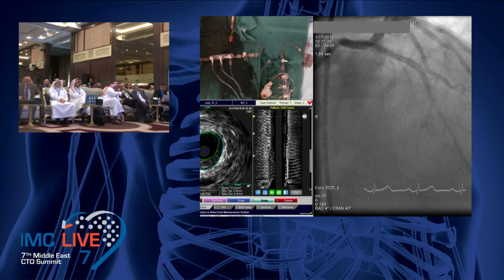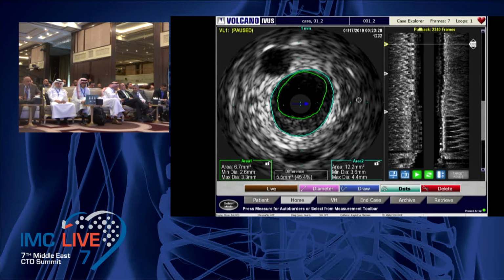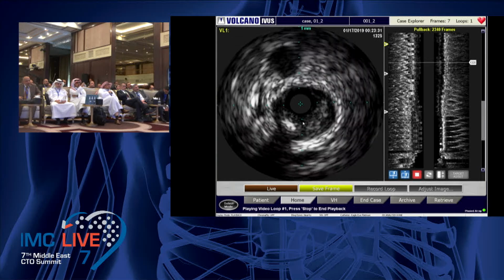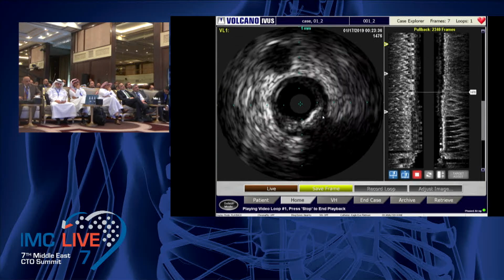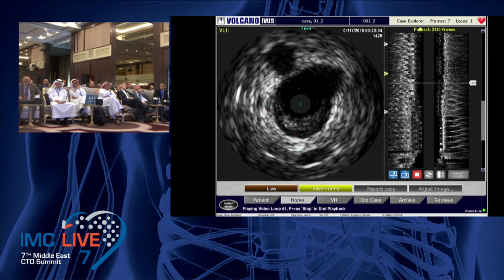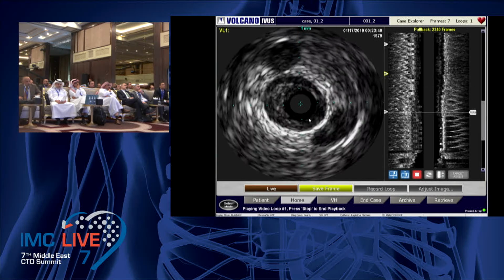Yeah. Okay. We are here in the distal LAD, where there is a healthy segment with minimal plaque. But if we move from here more proximally to the stent, you will see that there is a segment with a lot of disease, and at that level we were actually with less than 3 millimeters square of remaining lumen and more than 75% plaque burden. So it was difficult to leave this segment just distal to the long stent, and we decided to put an additional stent at this level.